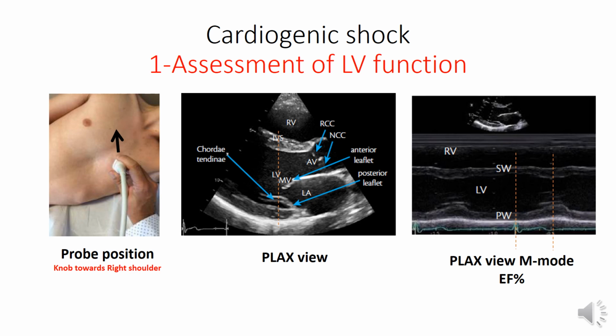This view is a tracing of this point of interest all through the cardiac cycle. At systole, the ventricular muscles are close to each other, and in diastole it is maximally dilated. If we have ECG tracing, the end diastole is synchronized with the tip of the R wave, and the end systole is synchronized with the end of the T wave.